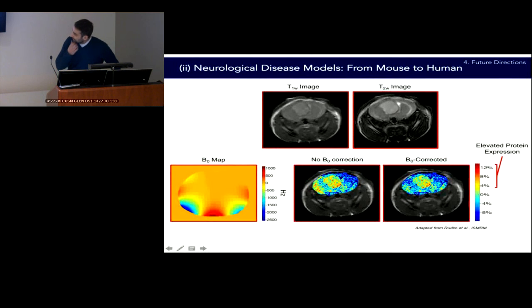Another area that I'm interested in working in, but haven't done a great deal in some time, is chemical exchange imaging. This is related to oncology. This is a mouse model of glioblastoma where the tumor is shown here in the standard T1 and T2 weighted images. And this slide shows a CEST map of relative amide proton content, shown from 0 to 12% here. Using CEST imaging, you can try to differentiate different tumor microenvironments based on their pH, looking at the amide proton resonance at 3.5 ppm. So I'm interested in doing this, but trying to get that up and running.